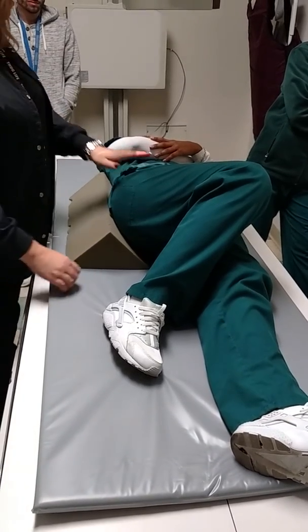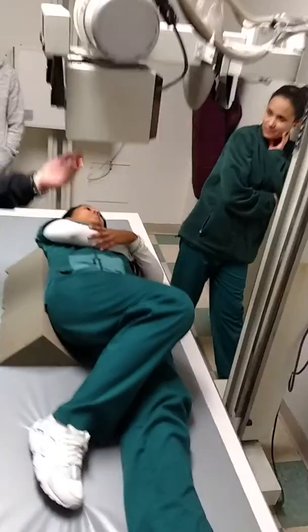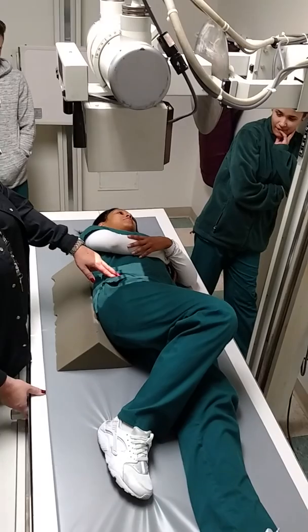Right, I get it. All right, so we said we wanted to see her right. So it is up. This one doesn't take a lot of movement. I'm going to start at ASIS and just go 2 inches below.